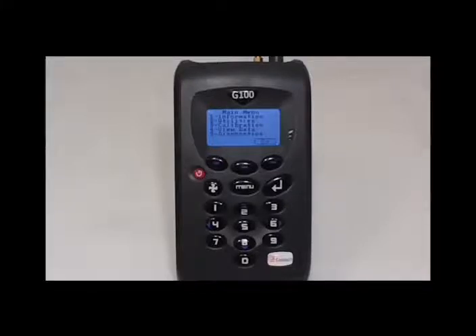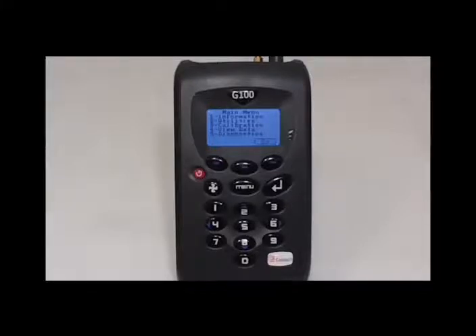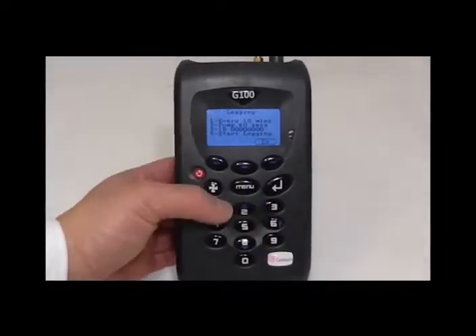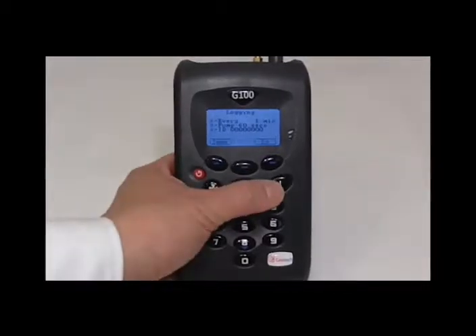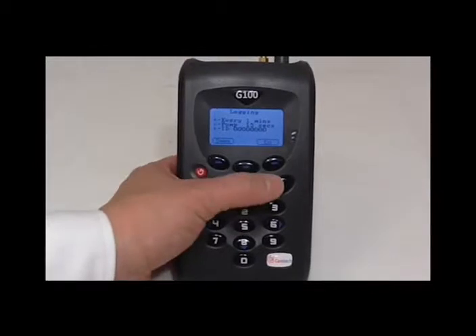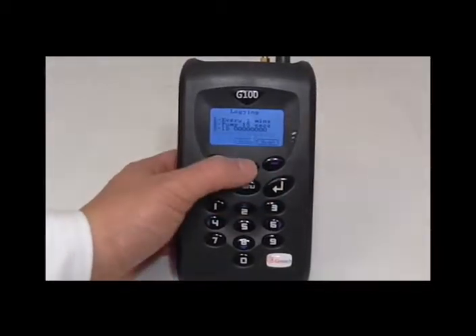To do this, please give the instrument a full charge of 3 to 4 hours. After, turn it back on and we will use the logging function. Set the parameters to a 1 minute interval, 15 second pump run time, and press 4 to start logging. Exit out of this and the instrument will start logging.